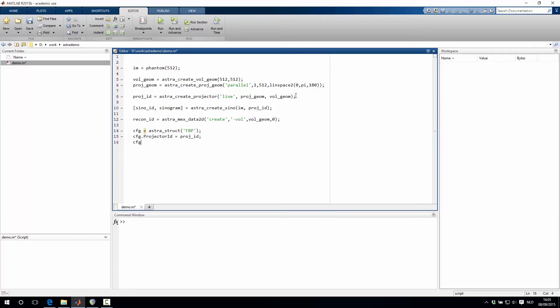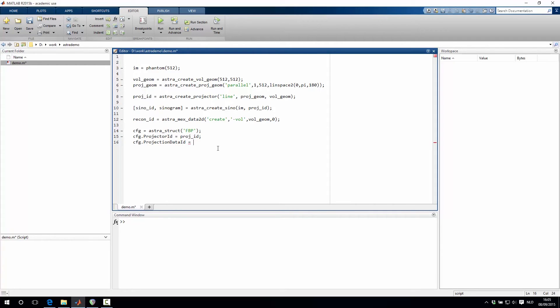Then we also need to add the projection data ID, which is this sinogram identifier that we created earlier. And then also the reconstruction data ID, which we've created just now.